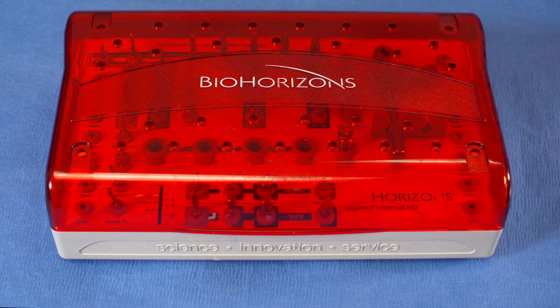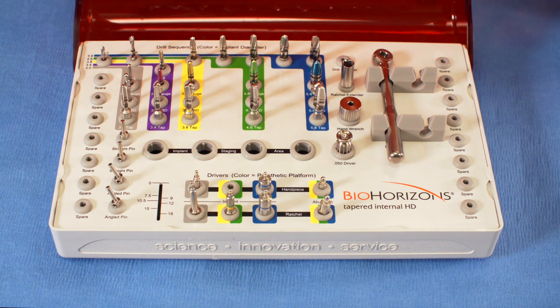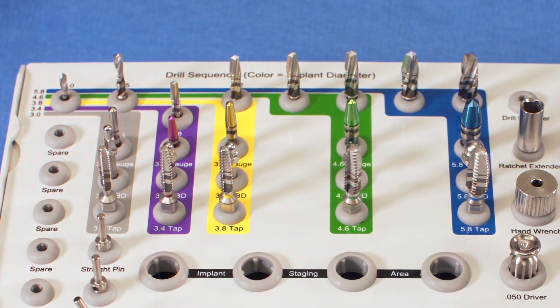The Tapered HD system all has the same surgical kit — that's a convenience factor. There is also a guided kit and a prosthetic kit as well, and we're going to explore all those kits here in just a moment. Now we're going to run through the Tapered HD surgical kit. It comes in an autoclavable case where the lid opens and can be removed for ease of use.